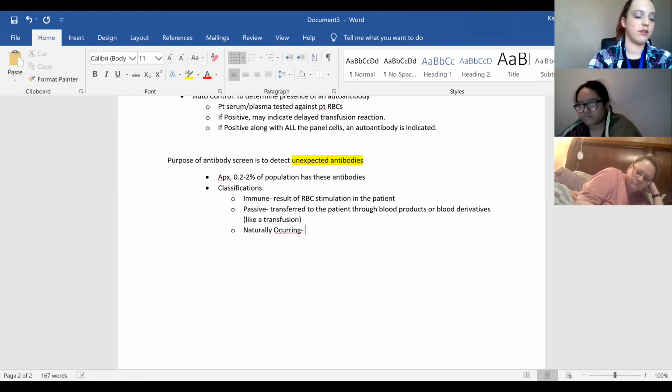There we go. I had the C right the first time. There we go.